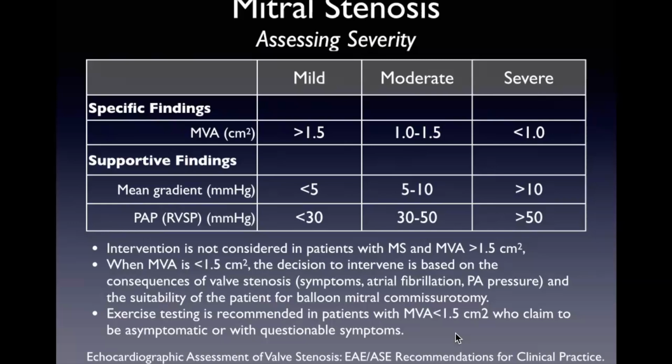So yes. How much does the AFib play into it? Because I remember scanning a patient once that was in and out of it during the study. They had mitral stenosis, and when I measured the gradients in AFib, it was much higher than when they were in sinus rhythm. Yeah, it could be related to rates, for example. So if the heart rate increases with the AFib, definitely, as the rate increases, that diastolic filling time decreases. There's less time for that blood to go from the left atrium to the left ventricle, and gradients will almost always go up in the presence of fixed stenosis. So it could be related to that.